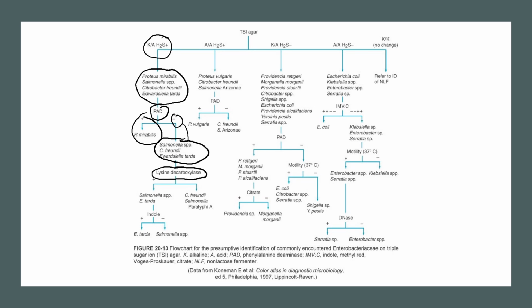here's another test in this flowchart that is called lysine decarboxylase. Remember a few slides before when I talked about amino acids, like phenylalanine, that some organisms decarboxylate or not. Some organisms do not decarboxylate, but they deaminate, and these are the PAD positive. And there are some organisms that produce the decarboxylase enzyme.